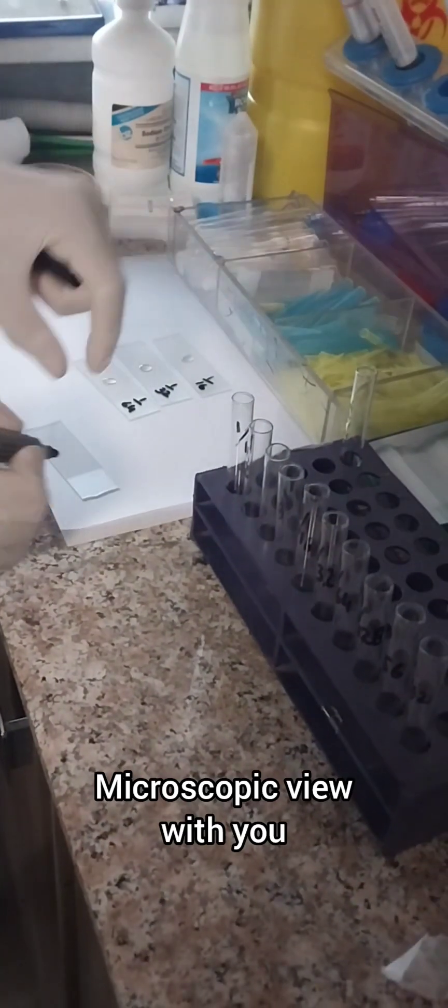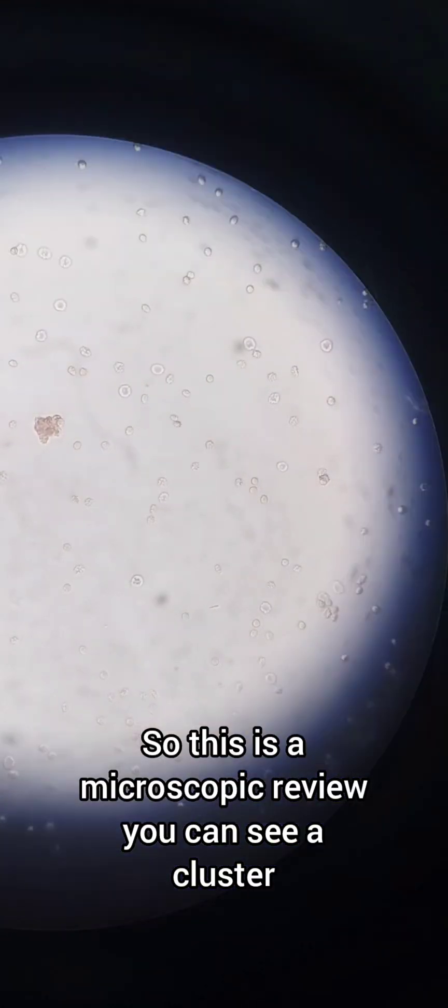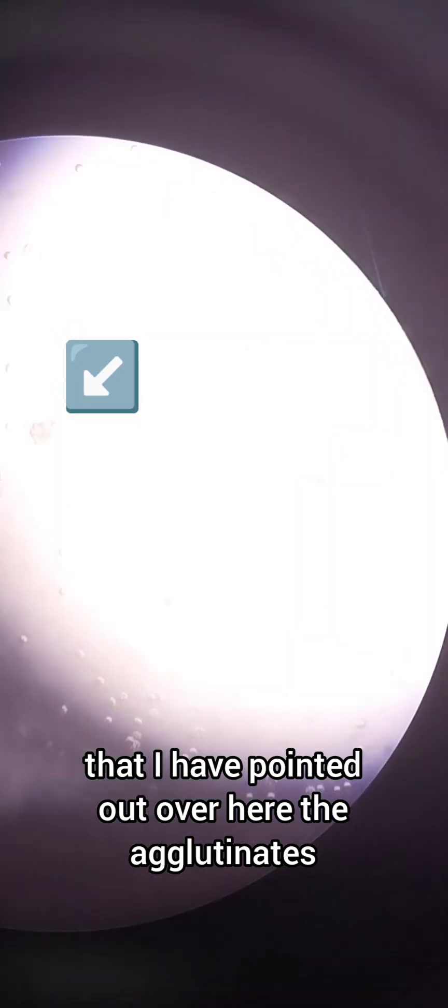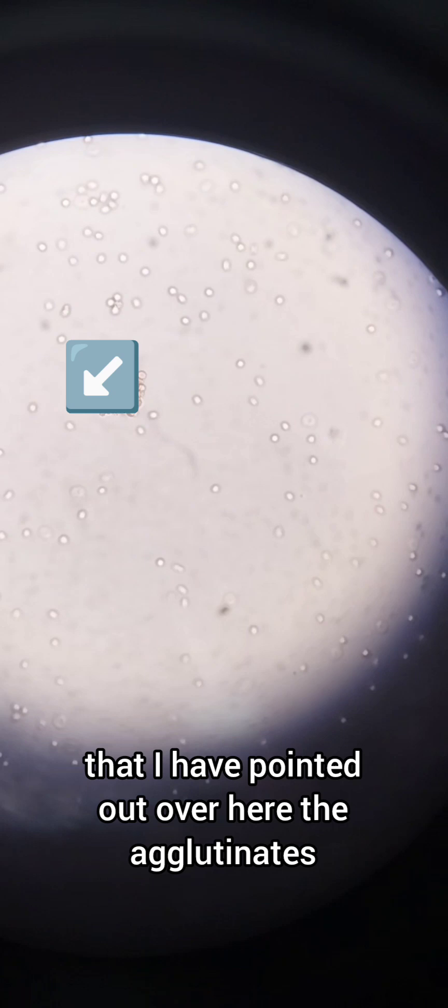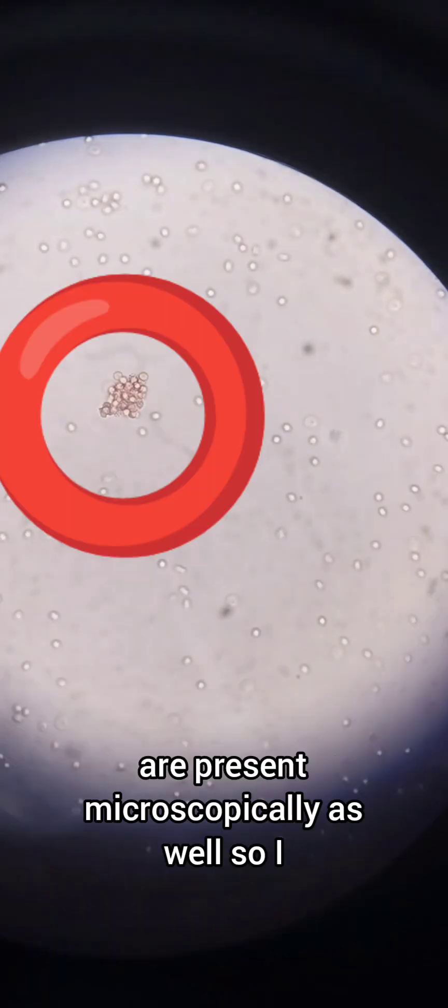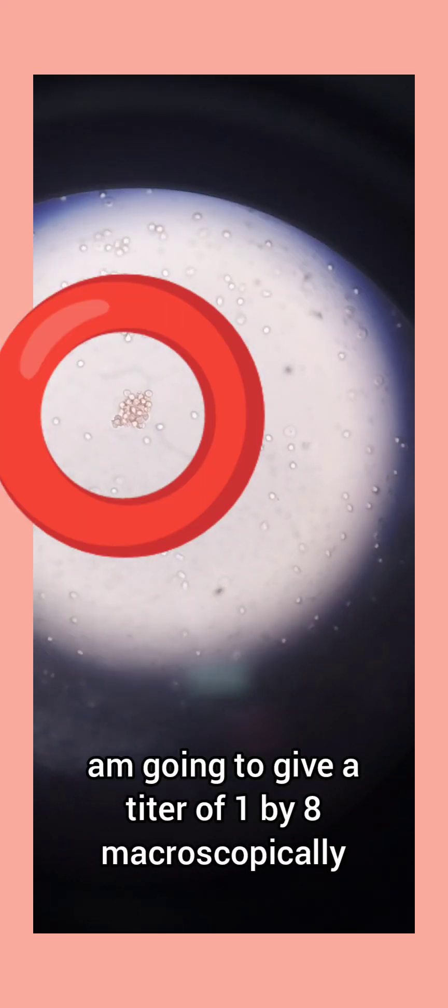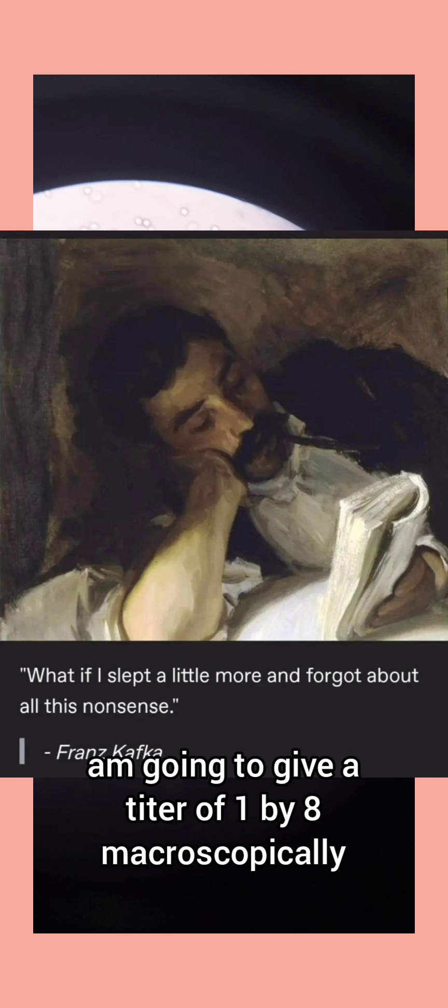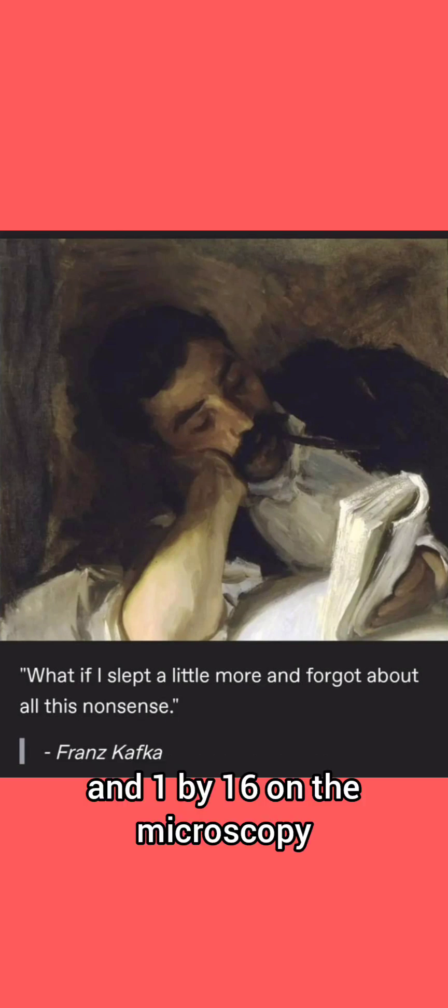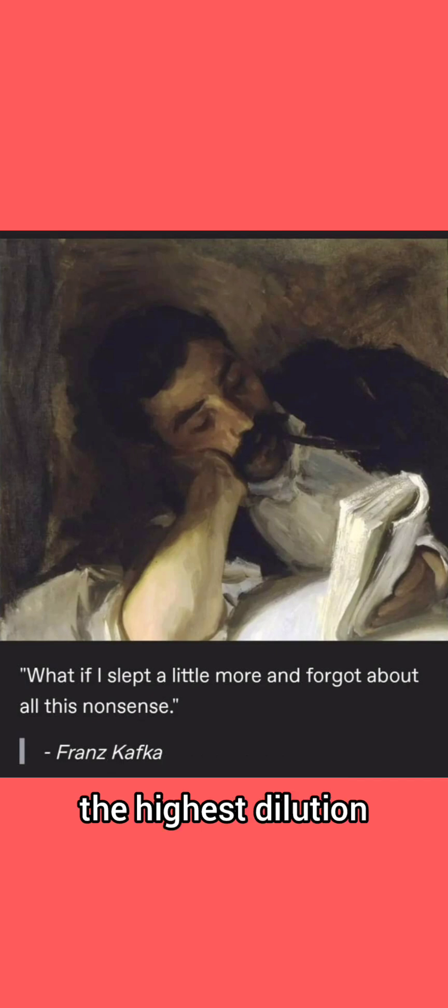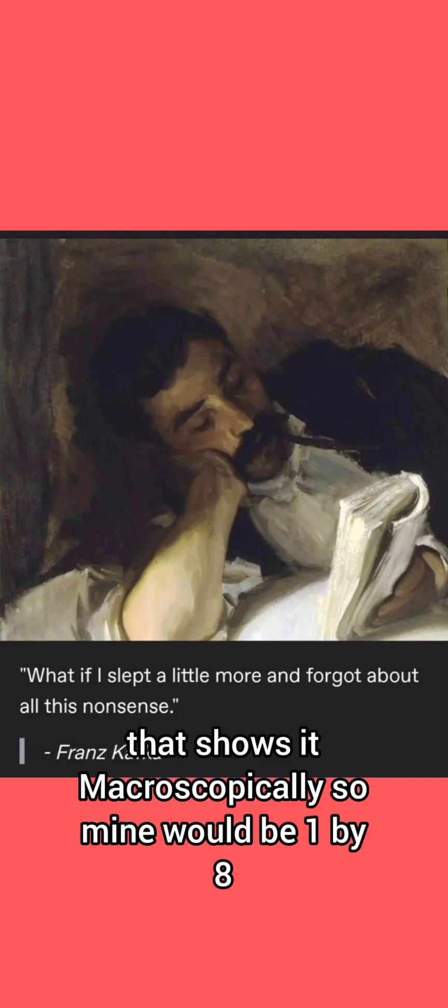This is the microscopic view. You can see a cluster that I have pointed out over here. The agglutinates are present microscopically as well. So I am going to give a titer of 1:8 macroscopically and 1:16 on the microscopy. Some books recommend that you should show the final titer as the highest dilution that shows it macroscopically, so mine would be 1:8.